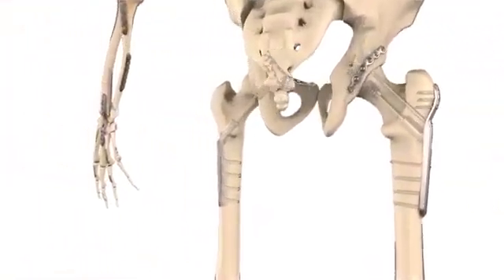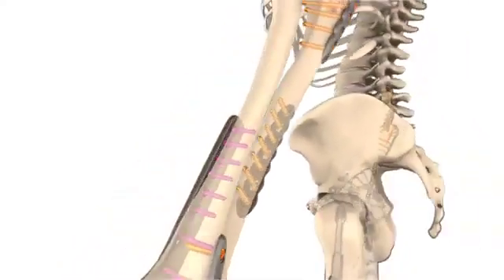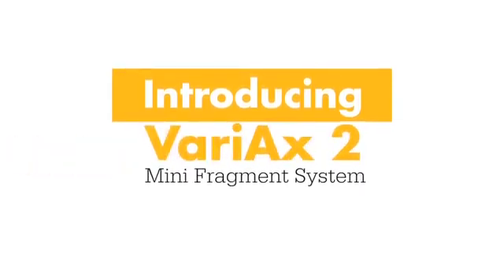Designed with you in mind, the latest addition to our lineup has broadened our plating portfolio while also complementing our full trauma product offering. Introducing the new VariAX2 Mini Fragment System.